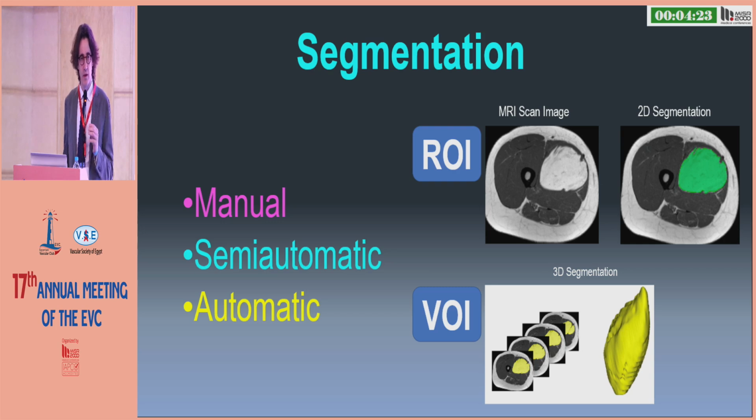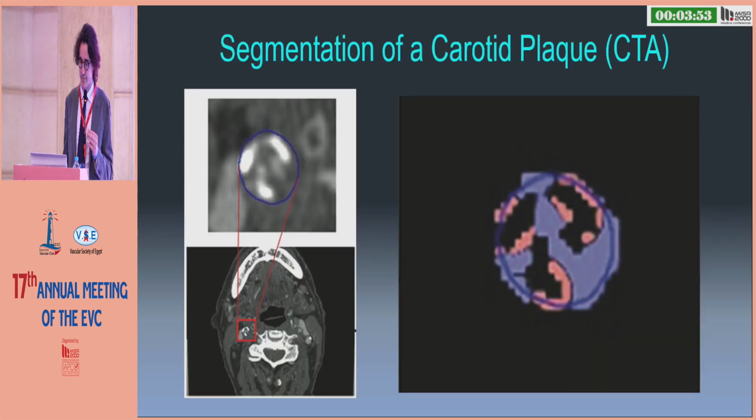However, there is software that has been developed to do semi-automatic or automatic segmentation of the images. This is a critical point of radiomics, as of course, what we are going to interrogate with radiomics is the area that we have chosen. So, if the area is precise, we will have precise information about the question that we are asking our imaging modality. If the segmentation is not precise, this will create a bias when we interpret our results.